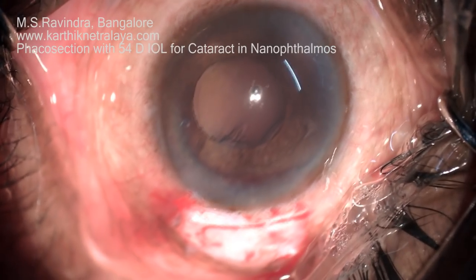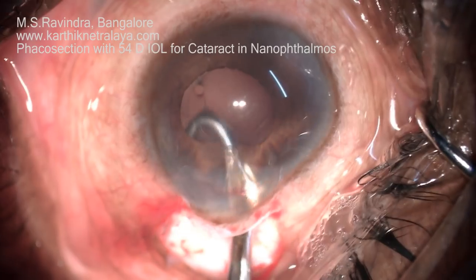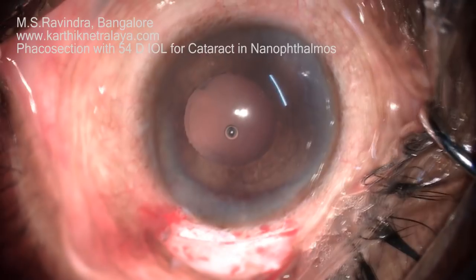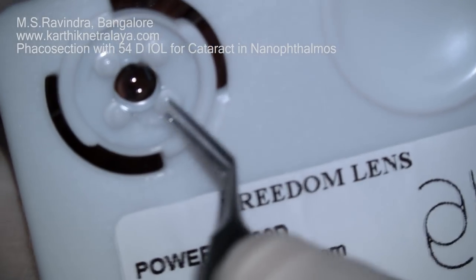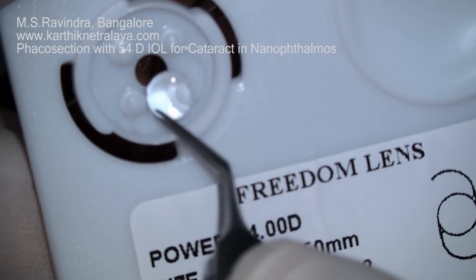Some of these patients were as young as around 20 years. The J-shaped cannula is used to remove the entire cortex. Complete cortical aspiration is essential to maintain a smooth post-operative recovery.